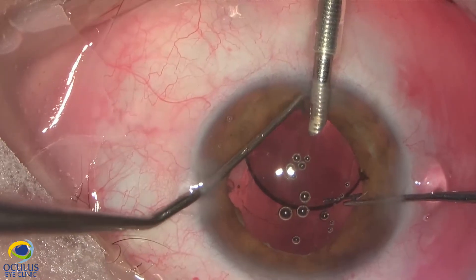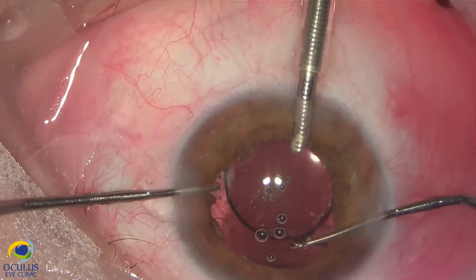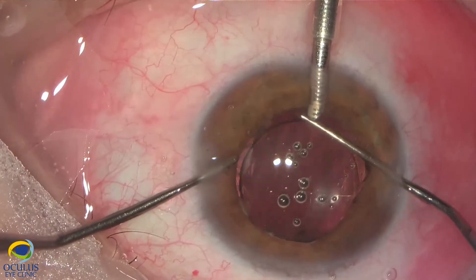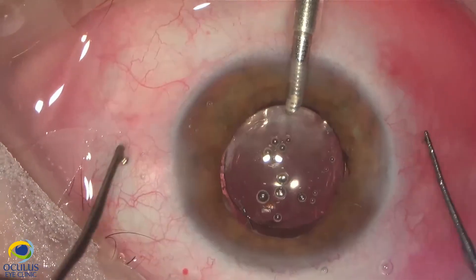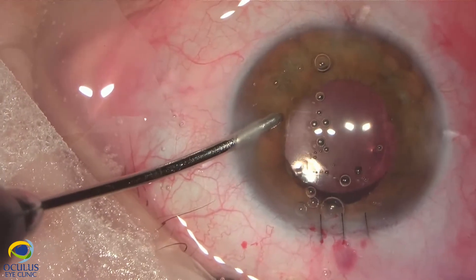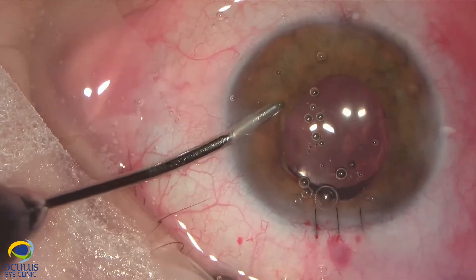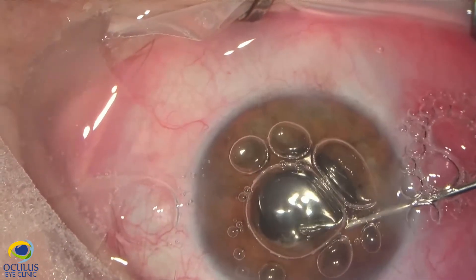In this case we really needed a lot of control because the peripheral capsular rim is quite small. We also had a synechia at 3 o'clock — a synechia between the iris and the capsule — and we needed to avoid that area. The IOL lies very well centered behind the iris. We washed the OVD and under air tried to pull the iris a bit at the 12 o'clock position.